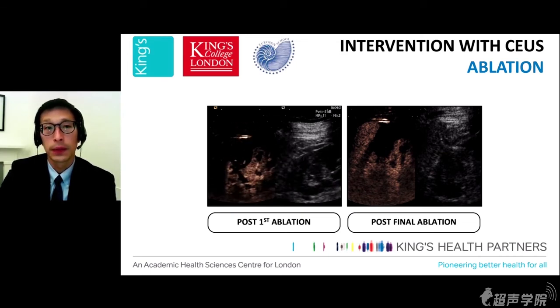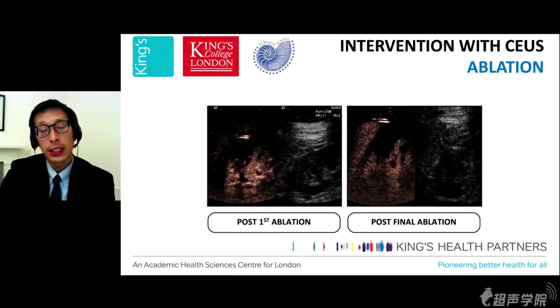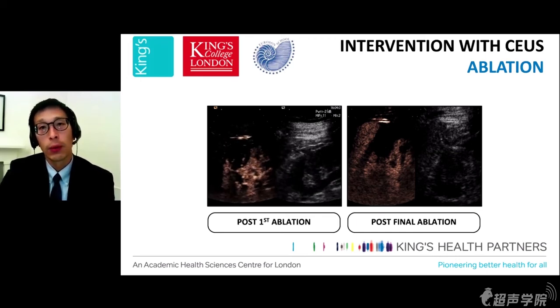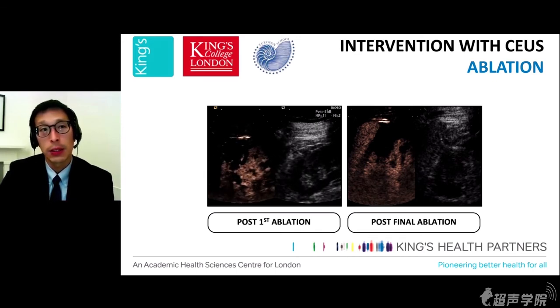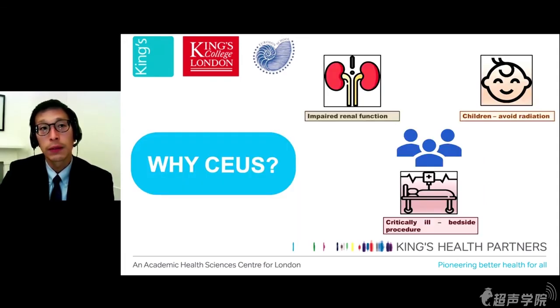And I think before we focus on more procedures, I just want to bring us back and pause for a second just to think, why are we using contrast-enhanced ultrasound for intervention? Because a lot of these procedures, including ablation, can be performed equally well with CT. And I think one of the reasons that contrast-enhanced ultrasound is beneficial is because of the patients that we are treating.